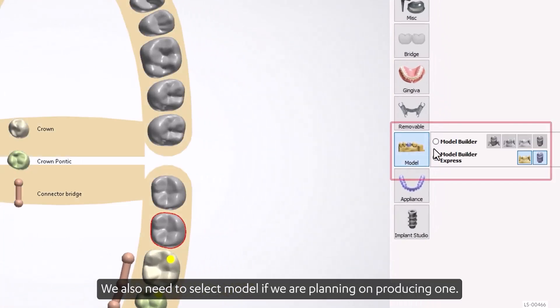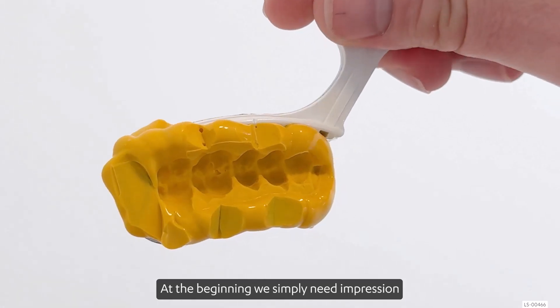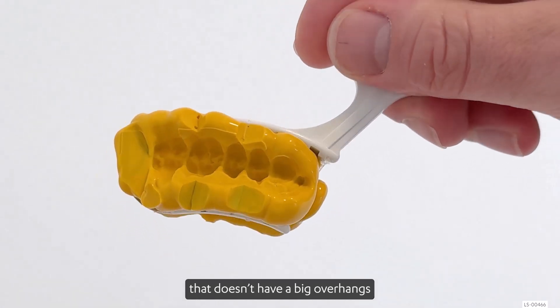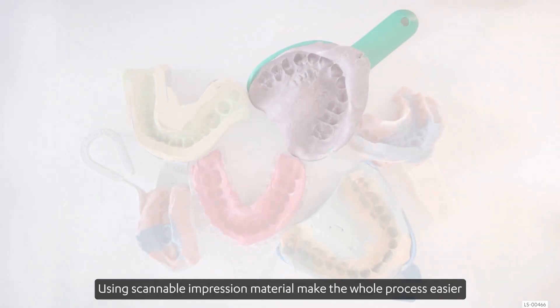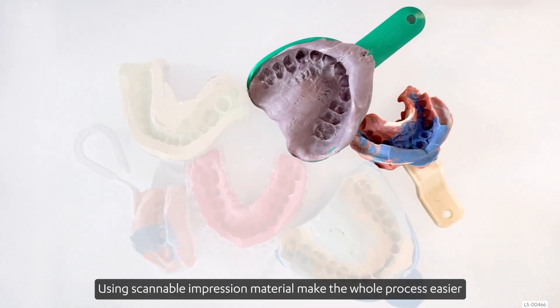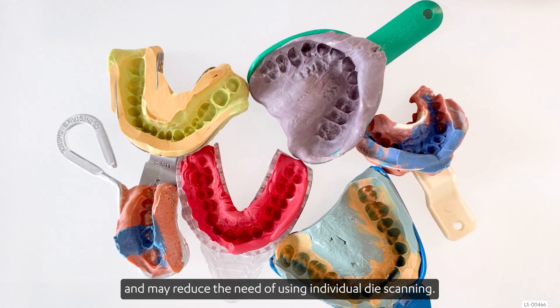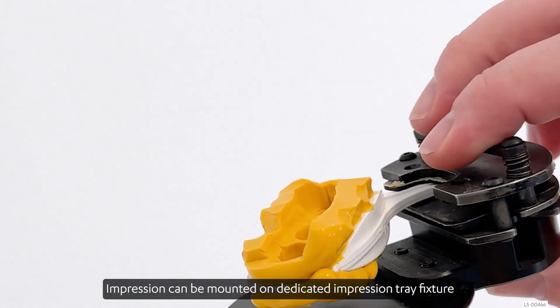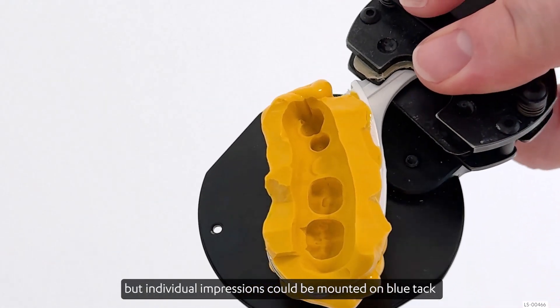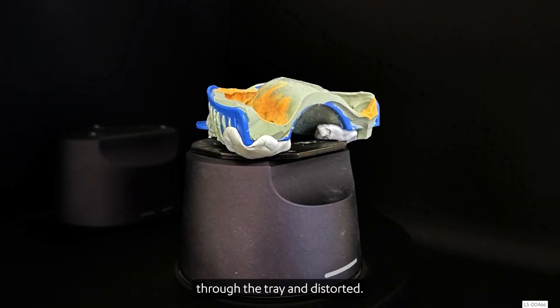We also need to select a model if we are planning on producing one. At the beginning, we simply need an impression that doesn't have big overhangs if it's not necessary for the case. Impressions of different colors can be used for scanning. Using scannable impression material makes the whole process easier and may reduce the need for individual die scanning. The impression can be mounted on a dedicated impression tray fixture, but individual impressions could be mounted on a Blu Tack as long as the impression material is not going to be pushed through the tray and distorted.